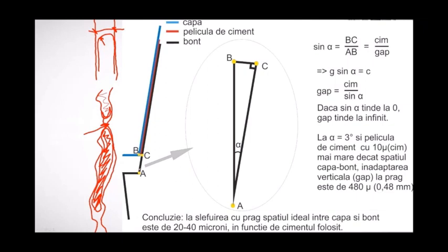If you feel a small retention just at the end of your checking the crown, that may be okay. But if it's friction all the way, that's completely wrong. So it has to go free until it does eventually a small tug back there at the end. You can check easily inside with impression material, and you see, is it very thin and almost washed away, or is it thick? If it's thick, you have a problem.